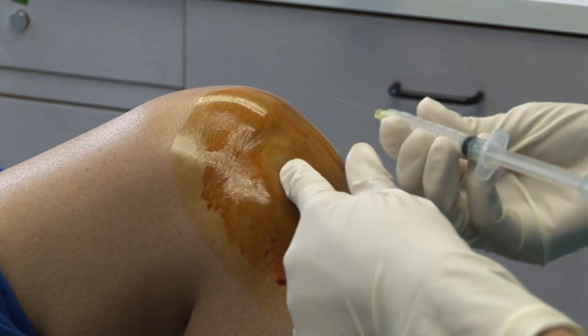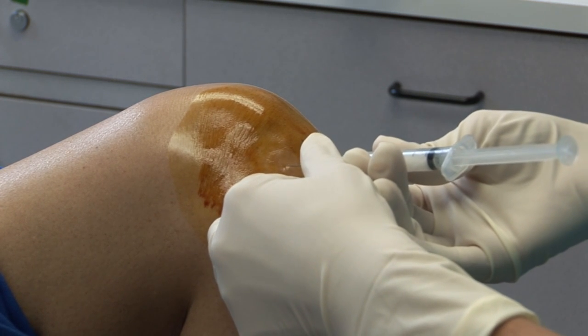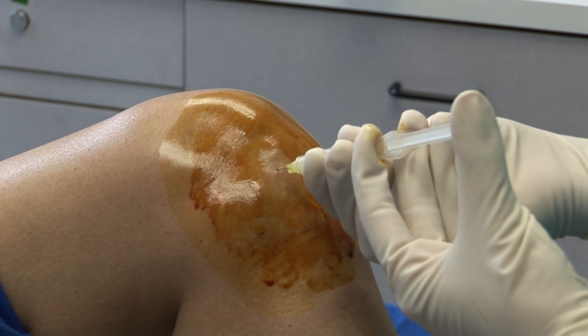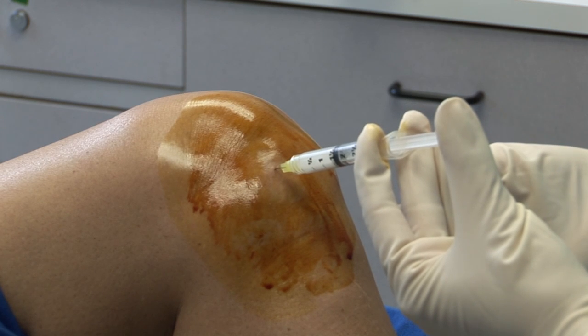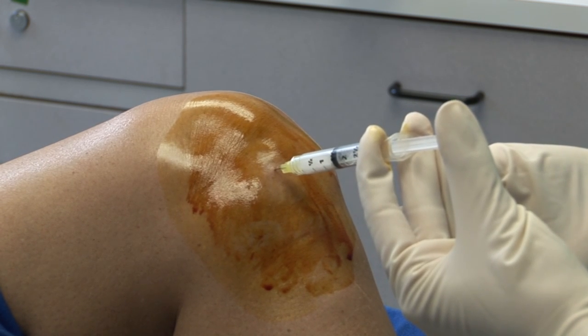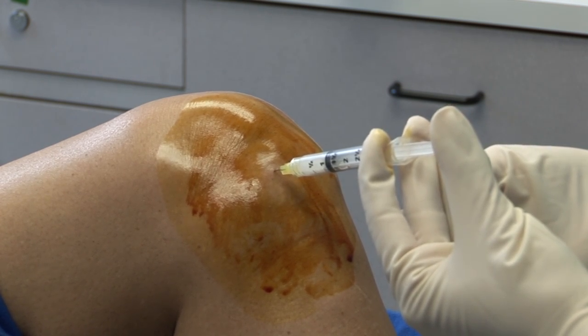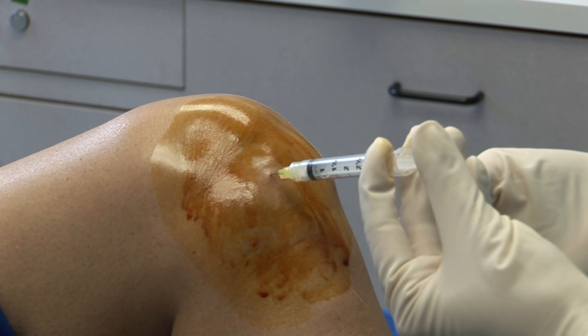Pass the needle parallel to the tibial plateau and angle the needle medially towards the center of the joint about 30 degrees. Insert the needle 2 cm into the knee joint space so that the tip of the needle is within the joint space. The needle should be directed under the patella but should not make contact with the underside of the patella or the condyles of the femur. Inject the corticosteroid solution into the joint space. There should be no resistance if the needle tip is within the joint space.